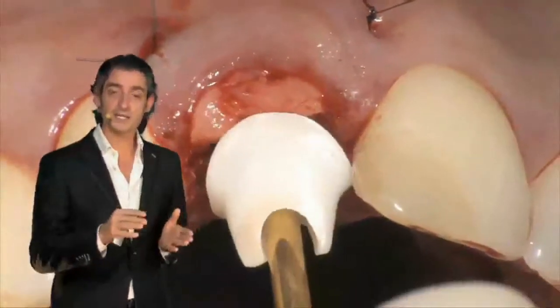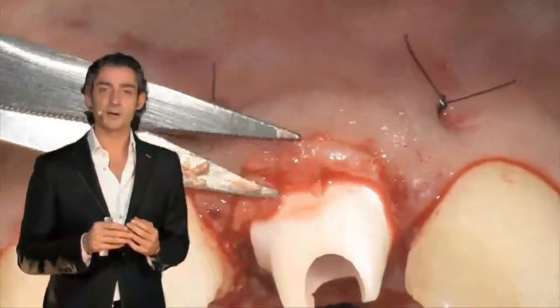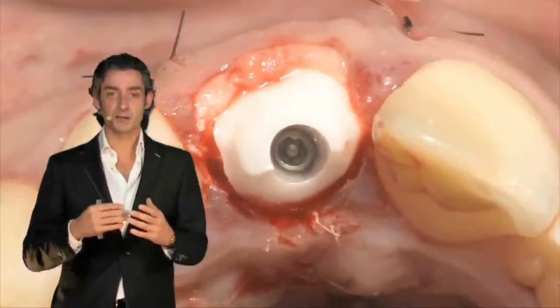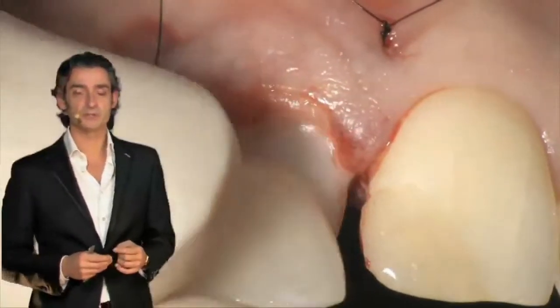And then in this case, this was my final abutment at the time of the surgery. I am removing the excess of the connective tissue graft just before, and then placing my temporary, provisional restoration.